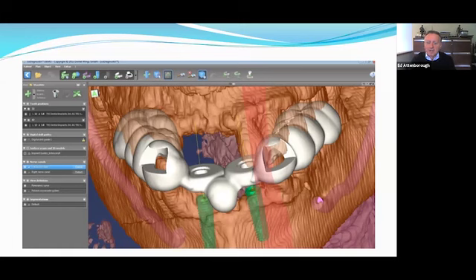Now, the second thing that we need to discuss is how these intraoral scanners integrate with the rest of the kit in the practice. And perhaps you have a CBCT unit in the practice, perhaps you refer patients for a CBCT, but we want to be able to merge the data from the intraoral scan with the DICOM data from a CT scan to do image-guided surgery, potentially for treatment planning. And this is where open systems are critically important, so that you can take data from one scanning modality, merge it with another, create a composite image, which can then be used for treatment planning.